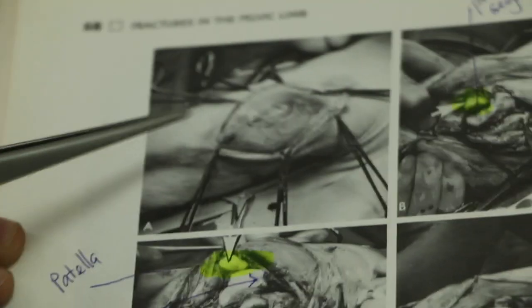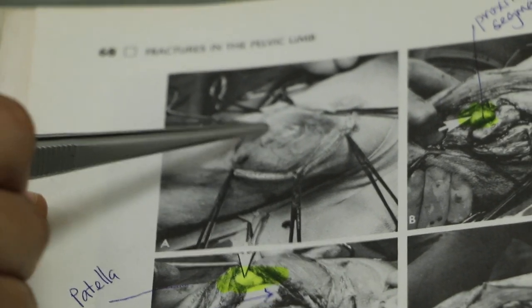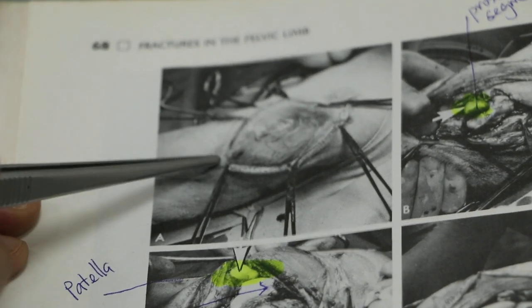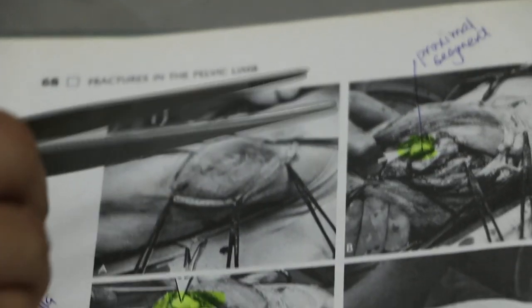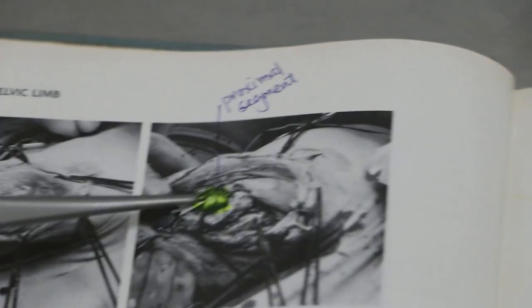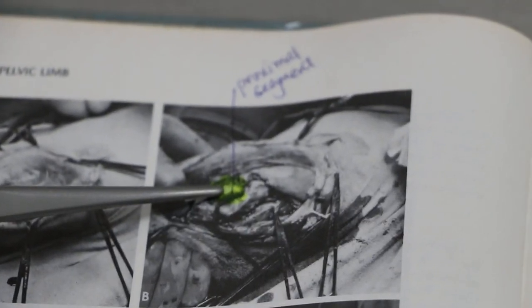Now a quick explanation of the surgical technique. First, we incise the skin and go inside. Then we can see the muscles, so we cut the muscle layer slowly and expose the distal and proximal segments. We expose the proximal segment so we can see the fracture fragments clearly.